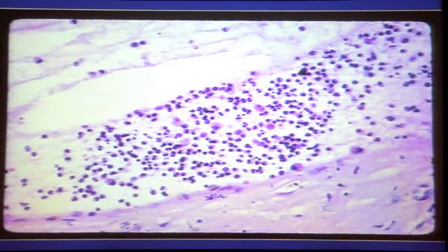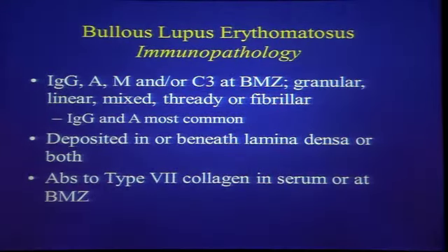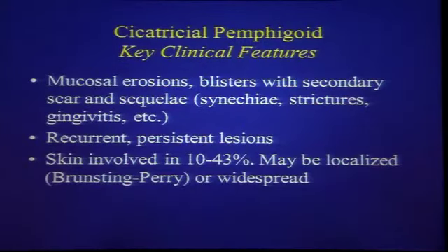So sub-epidermal blister with neutrophils, you think of DH, you think of this, you think of linear IgA bullous dermatosis, sometimes EBA, relatively few number of diseases. If you do an immunofluorescence here, you're going to see multiple immunoreactants at the dermal-epidermal junction, usually more of a granular pattern than a linear pattern. So here you see that in this photomicrograph.